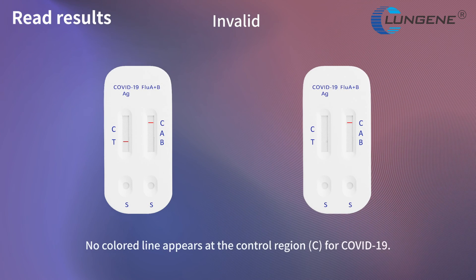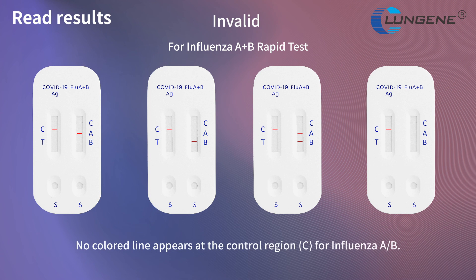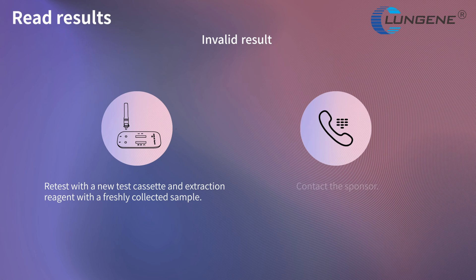Invalid result: no colored line appears at the control region for COVID-19 or Influenza A/B rapid tests. For an invalid result, retest with a new test cassette and extraction reagent with a freshly collected sample.